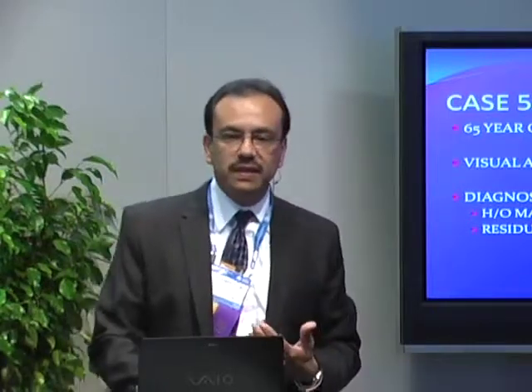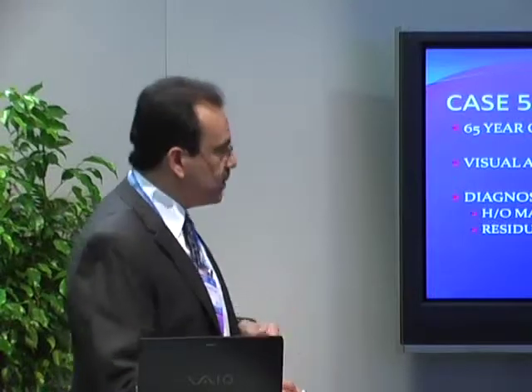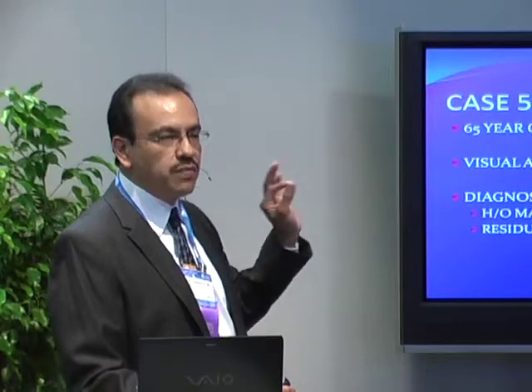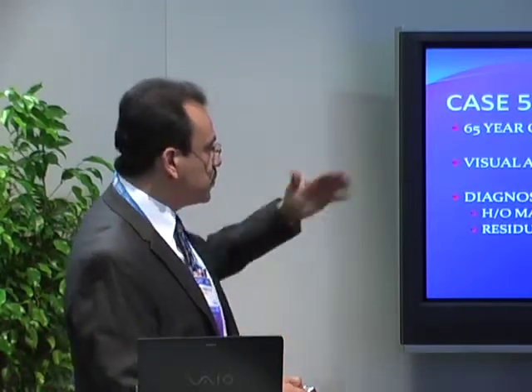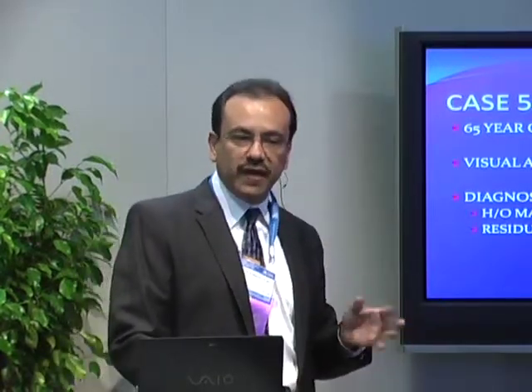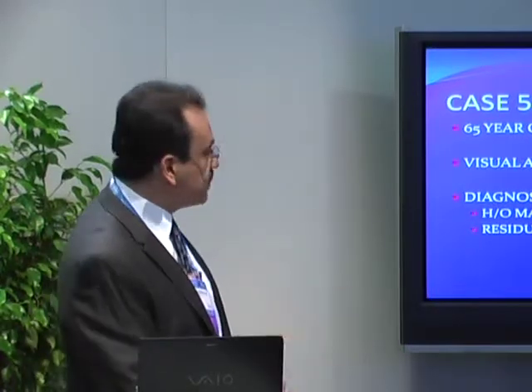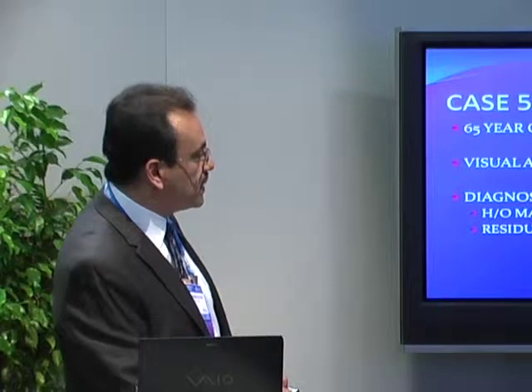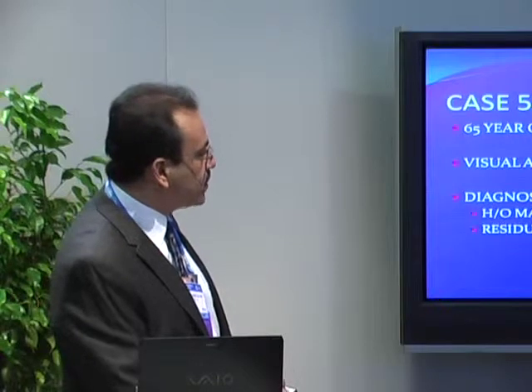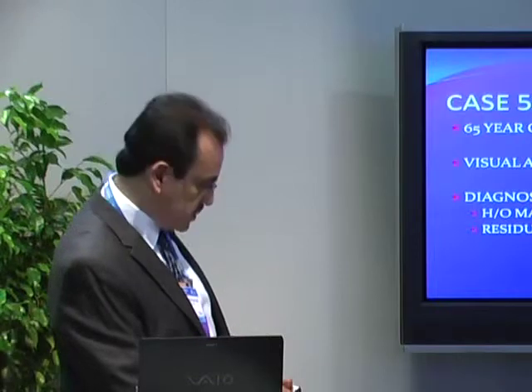Now this is an interesting patient. For those of you who do retina surgery, quite often, and this is a more obvious case, but I wanted to use this one just because it drives home a very important message, and that is you do surgery on a patient. Anatomically, the OCT looks fantastic, but then the vision's not good. This is a patient who had a macular hole, and the pre-op vision was about 20/400. Okay, the post-op vision, as you can see, count fingers, and this is months after we did the surgery.